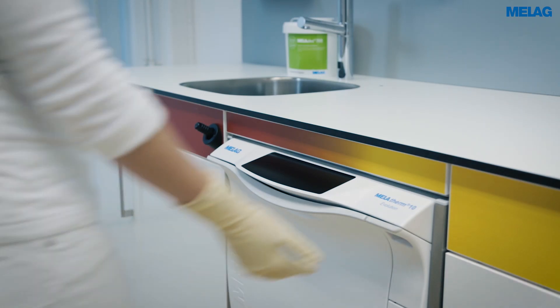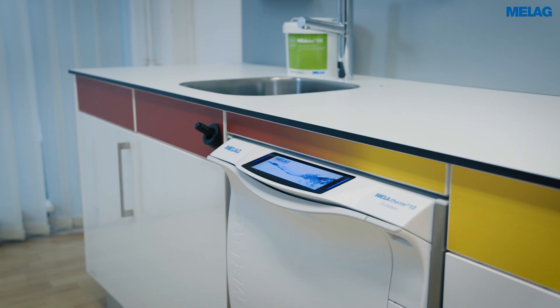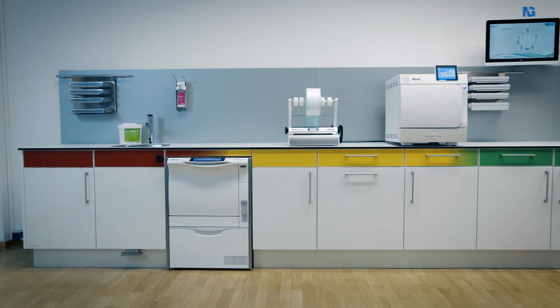To recommission the device after a long pause, you only have to start the air removal program and the usual disinfection program with an unloaded base basket.